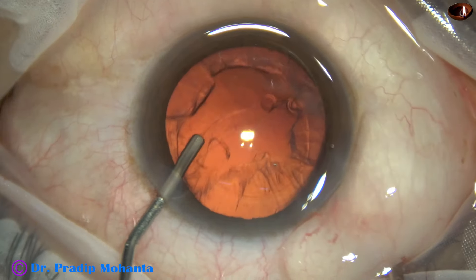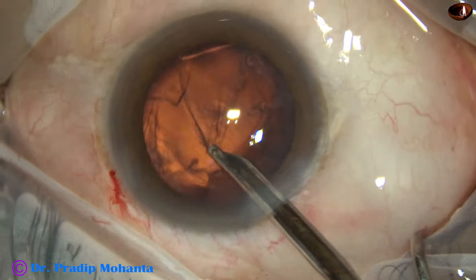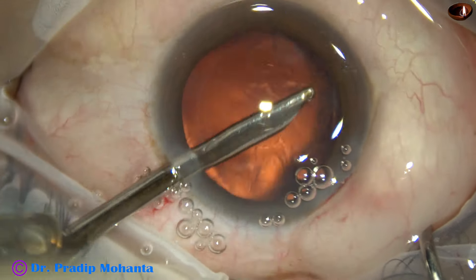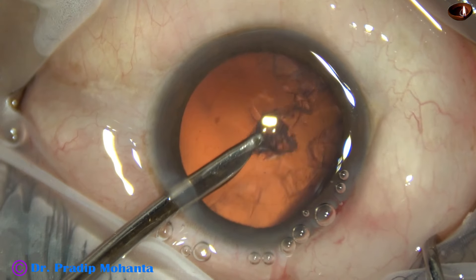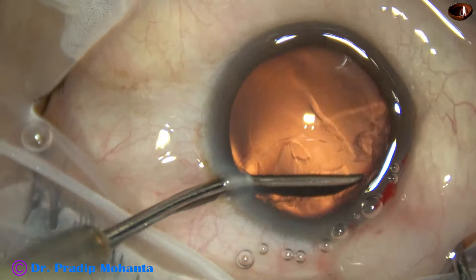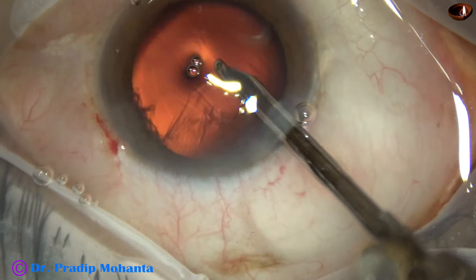The anterior chamber is again filled up with visco and cortical clean-up is being done with the help of a 23-gauge Simcoe cannula. The Simcoe is very thin and it goes through a 1.7 millimeter side port. Cortical clean-up can also be done with coaxial irrigation-aspiration or bimanual irrigation-aspiration, whatever way you want.